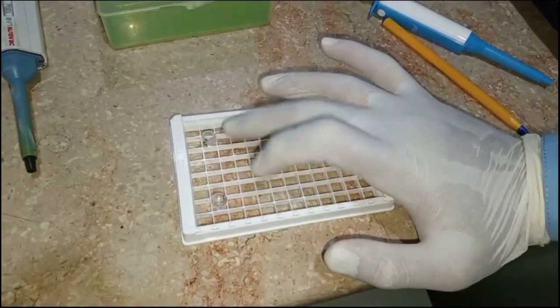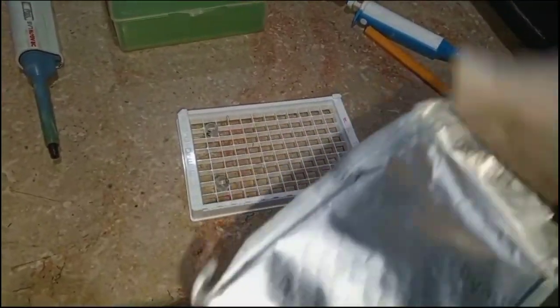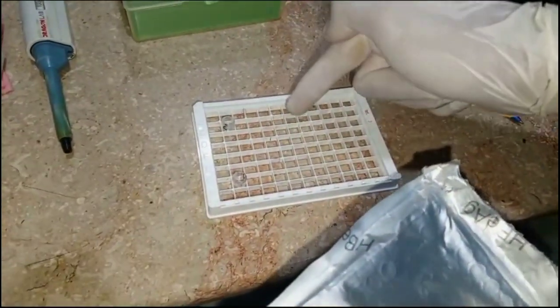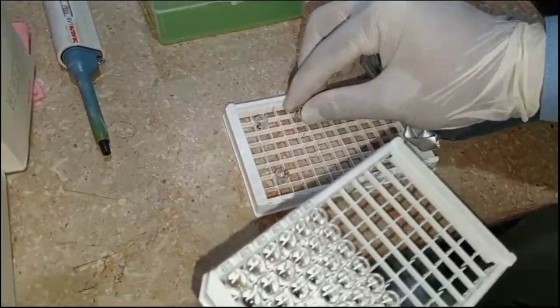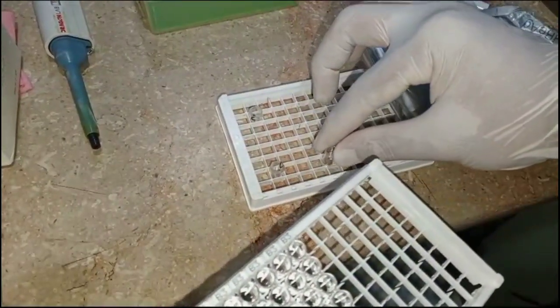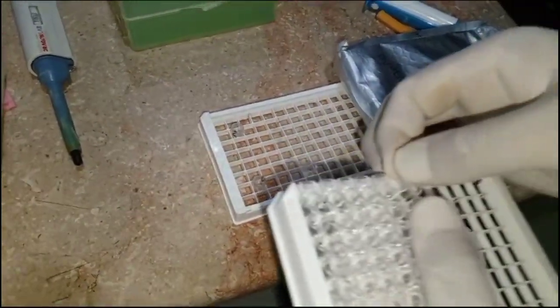So this is the ELISA plate. Now this first well that we have taken is the test. Now we should also take the positive control and the negative control. It means that we should take 2 more wells for HBeAg and HBeAb respectively.